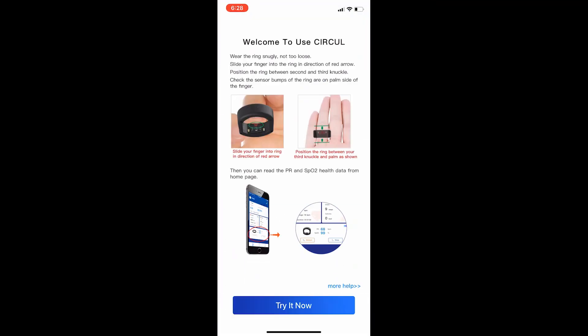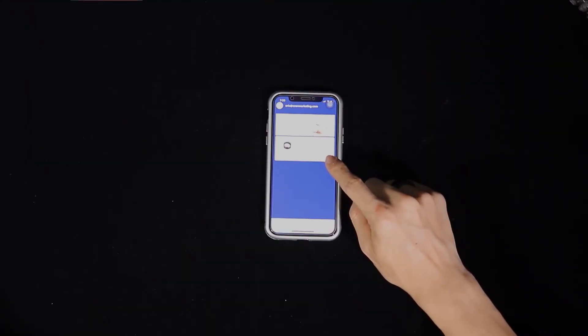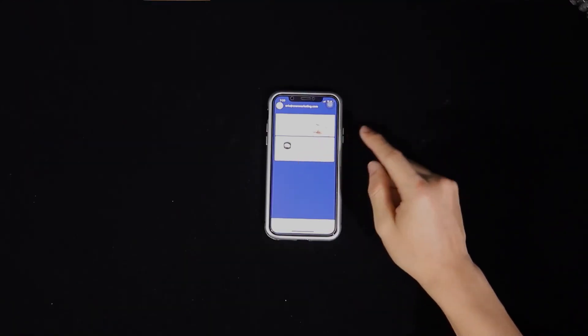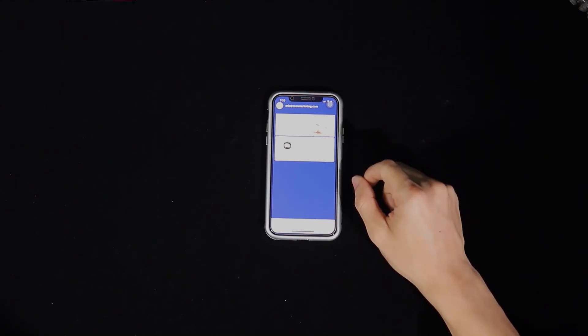Keep still when checking your resting SPO2 blood oxygen. This is for accurate measurements.